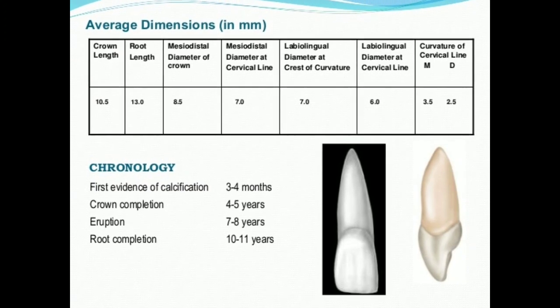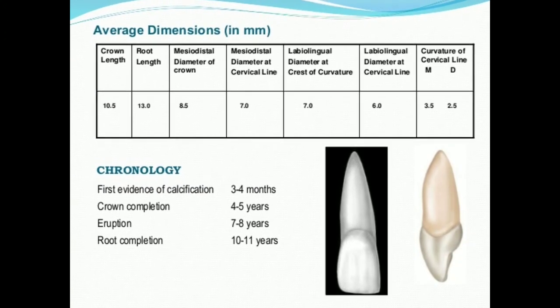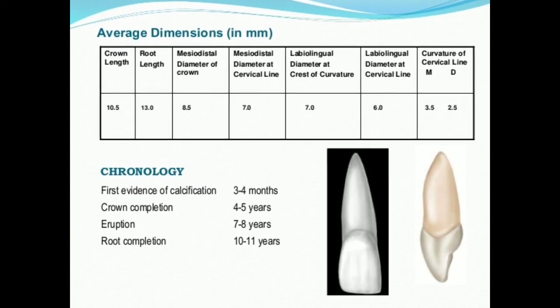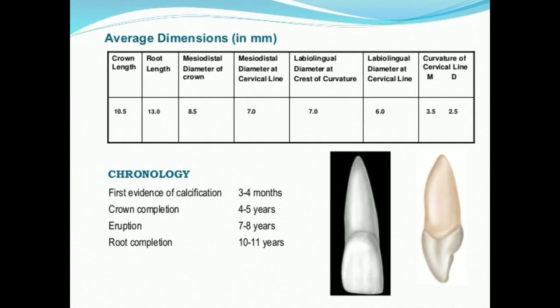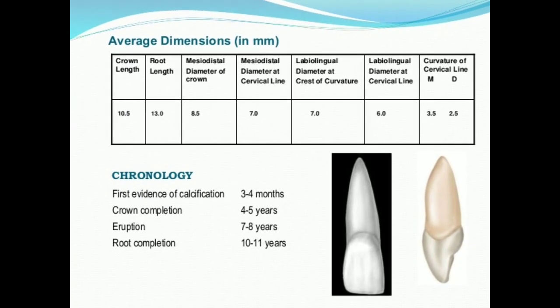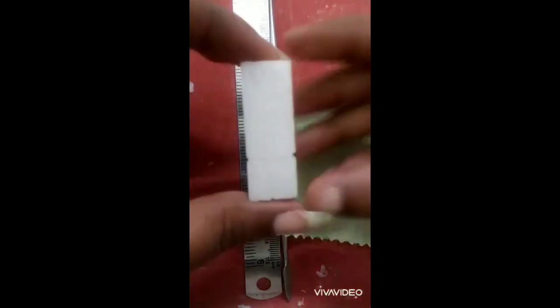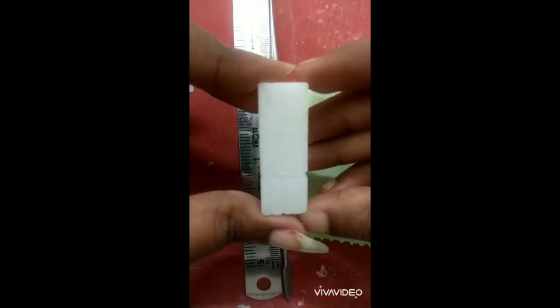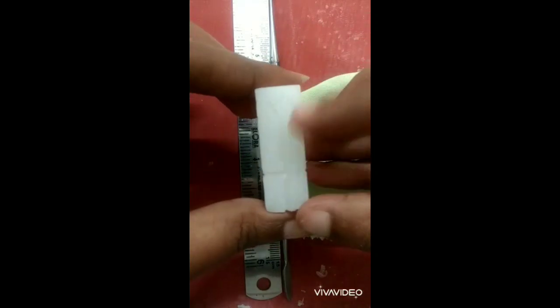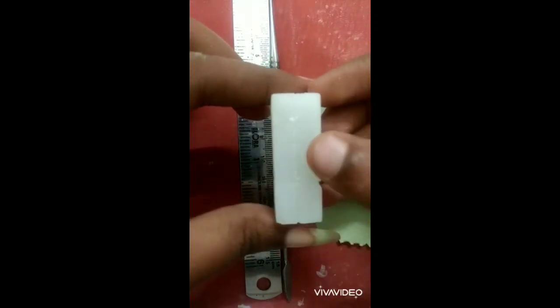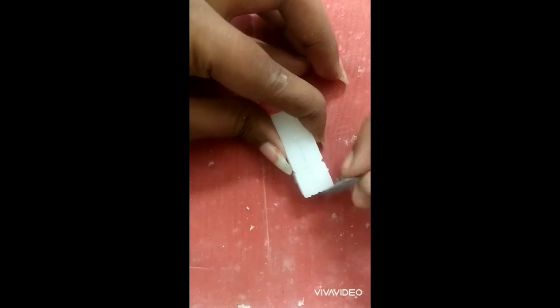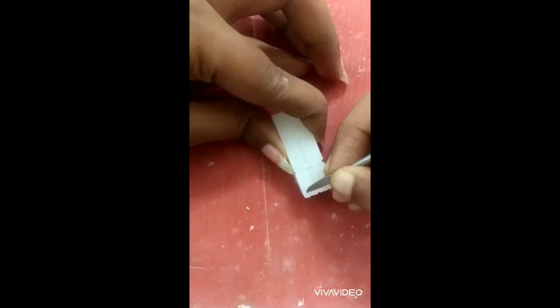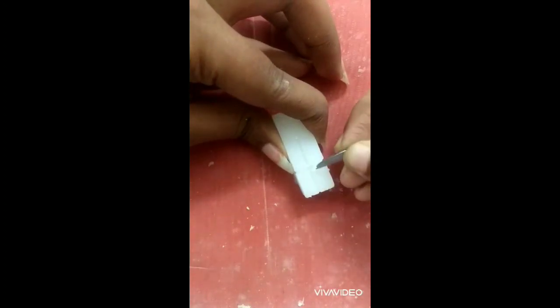We have two dimensions: the crown length is 10.5 mm and the root length is 13 mm. First step — the wax block has four sides: facial, lingual, mesial, and distal. The crown length is 10.5 mm.